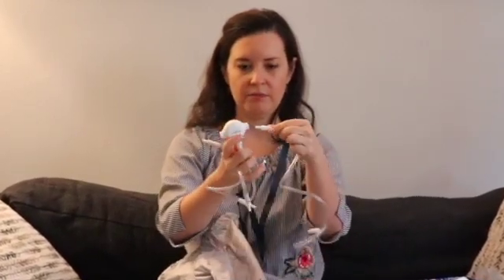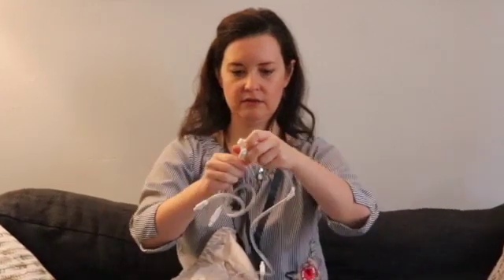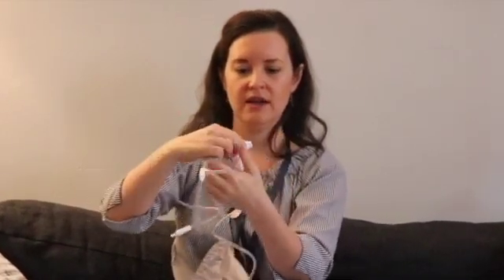And then we're gonna plug it into the sides here. So this is for your, did it backwards. So the long tubing goes in the bottom, and then the two shorter pieces go on the sides.